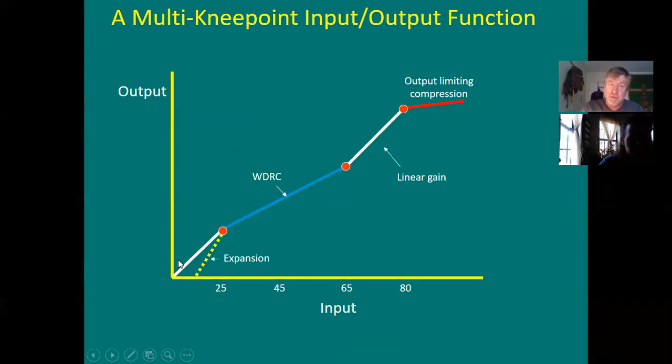Look at that white and this white. They're both 45 degree angles. Oticon is doing this. They call it Speech Guard. And they're doing it to overcome the complaint: I hear people better at tables further away than I do the person across the seat from me. And we've all described why that is the case. Because WDRC is amplifying soft sounds by a lot and louder sounds by less. So the person across the table from you is louder, so WDRC is amplifying that person less, and the people further away are softer, and it's amplifying them more.